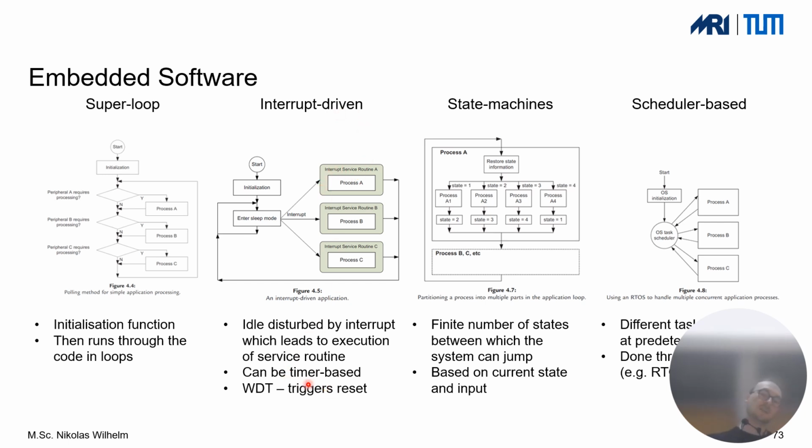If you remember, you have those watchdog timers connected to your CPU. So you can directly go in there, break everything that is happening right now, all the calculation that the system is doing, and say, okay, this has priority. We have that interrupt. There is that respective event that happened, and we will now perform this respective routine to avoid some kind of danger or security risk for the patient. So that's the interrupt-driven design.